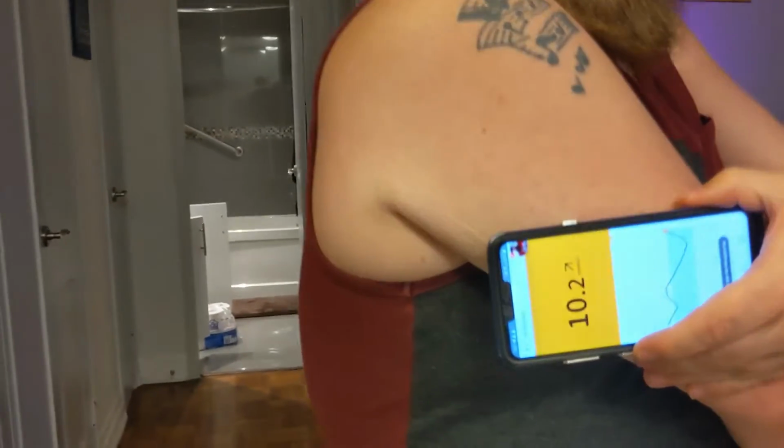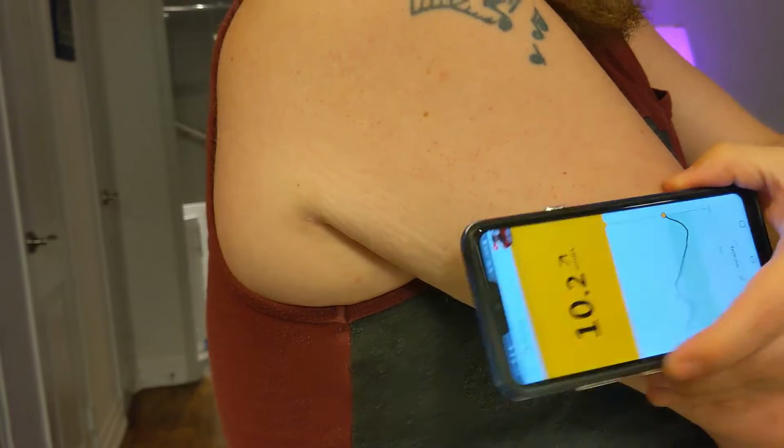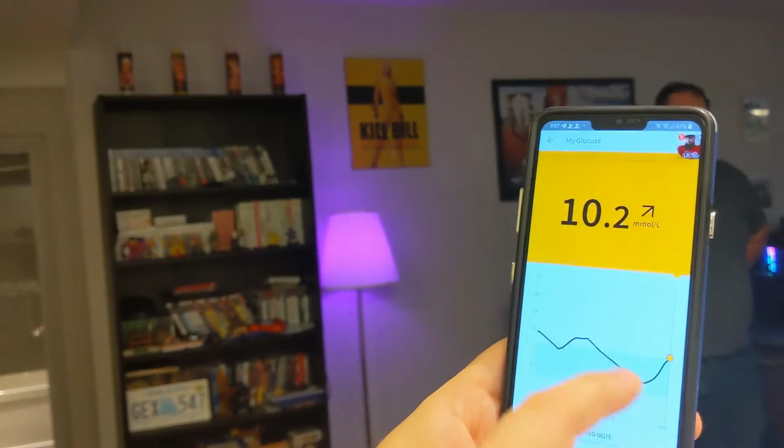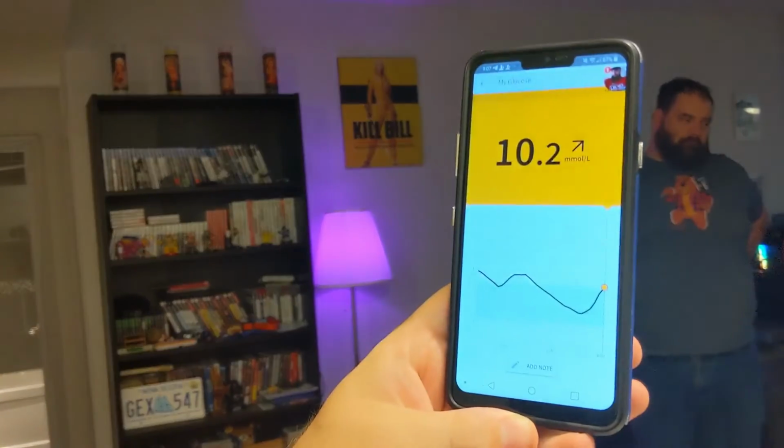All right, so this is actually how it works. So you'll see that, I know, it's a little high right now because I had supper, but you can see that it has a running graph, and you can see that it was good before supper and it spiked a little bit, which is normal after supper, so I'm okay with that. But that's how the sensor works.